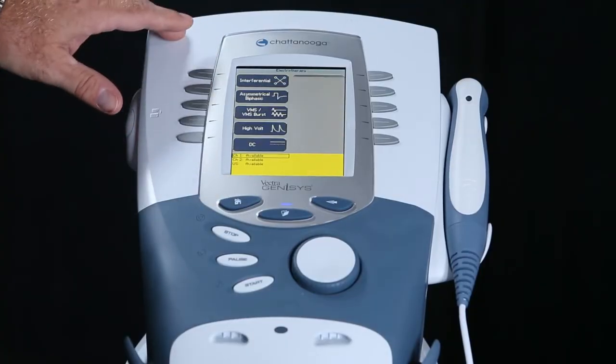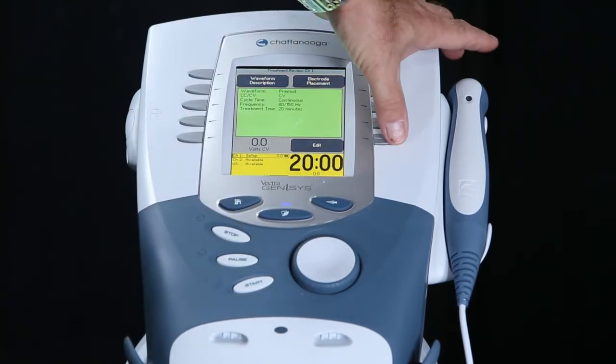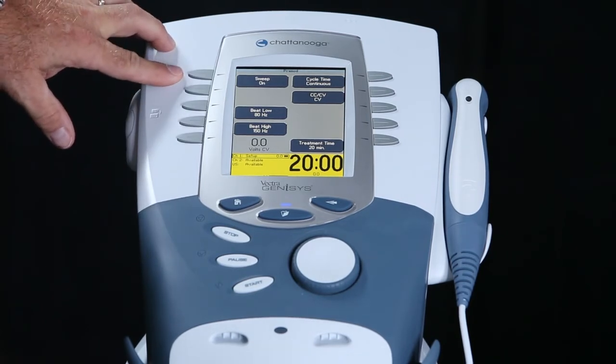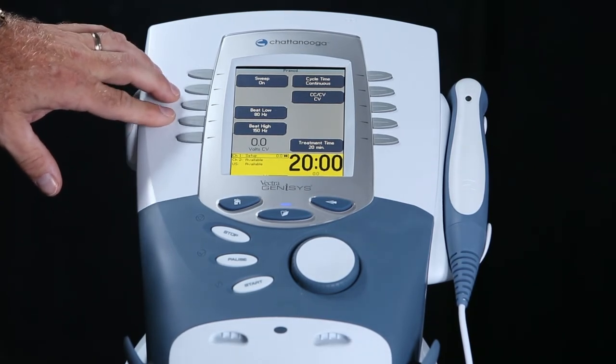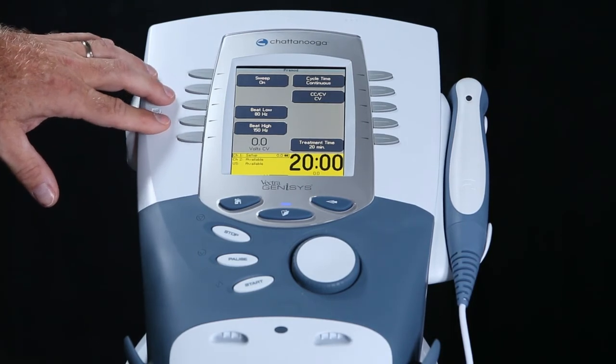Now, let's press the electrotherapy key. Then we'll press the Pre-mod key. Then we'll press the edit key to change our parameters. The first parameter, sweep, is set at on. That's where we want it to be. Our frequency is set at 80 and 150. We'll leave that there since we're going to use a gate theory protocol to treat this knee pain.